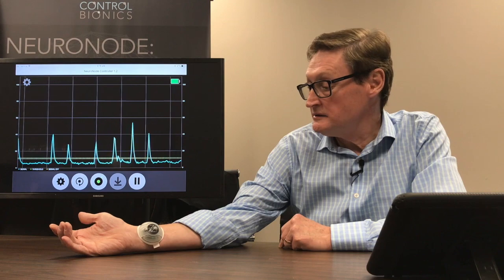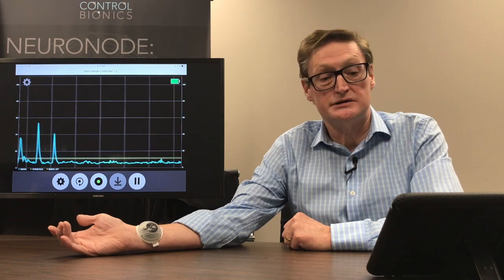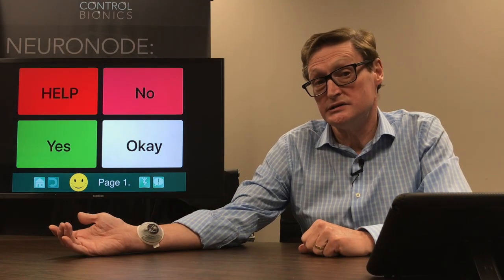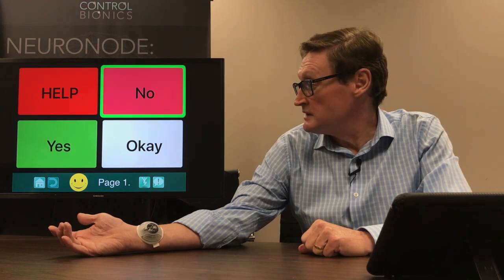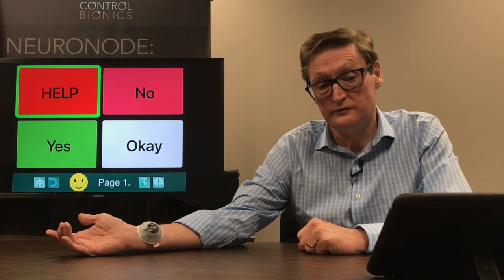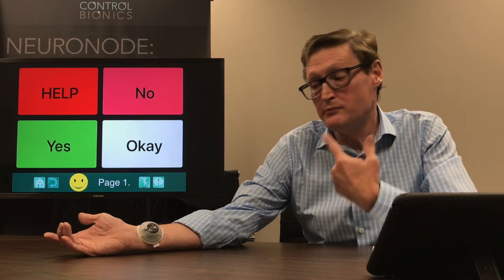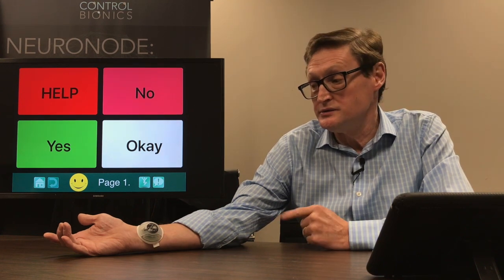So once I can create a signal, which is wirelessly sent to the device, I can then begin to turn that into communication. So let's see how that works. Now, for example, if I have a standard board package, I can initiate a board communication by simply initiating a click. And I can wait till that gets across to a yes, and then make another selection. Initiate again, and I can wait to a no, for example. No. So very simple communication, all done by my mind communicating down my arm and my device picking up that intention, which was to move my index finger.